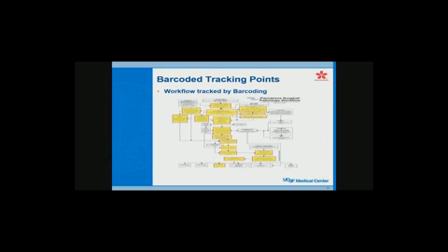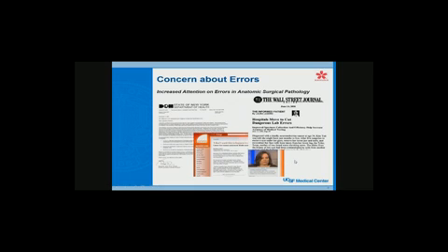Our process is actually much more complex. This is a diagram. It's not meant to be read. It's just meant to show you the spaghetti of our actual process. This is the type of process that's actually going on when a specimen starts at the top and moves its way all the way through the system to a final report. Now, barcoding will affect the yellow boxes in this diagram. So it doesn't affect everything, but what we're trying to do is apply it to as much as possible. As soon as we get the specimen, we want to start the barcoding, and then when the final report comes out, we want to have that be the end of it.